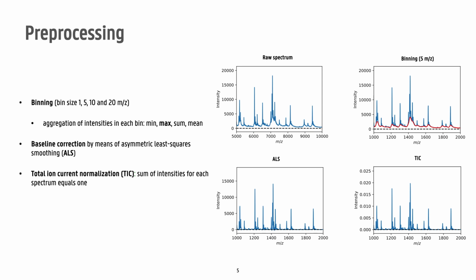Most of the machine learning methods described in literature, and more precisely the ones that were considered in this work, require MALDI-TOF mass spectra with a fixed length representation. As such, the first pre-processing step that we considered is a so-called binning step. This step consists of dividing the mass over charge dimension in intervals, or bins, and aggregating intensity values in each obtained interval for each spectrum.